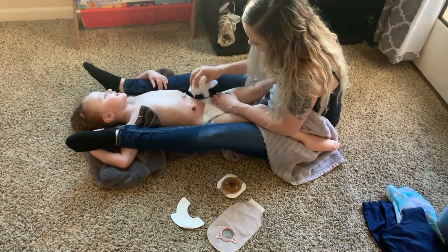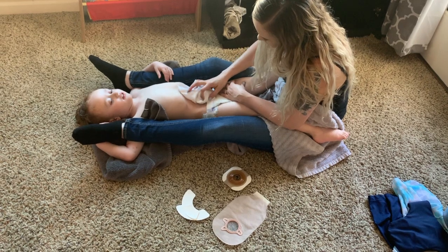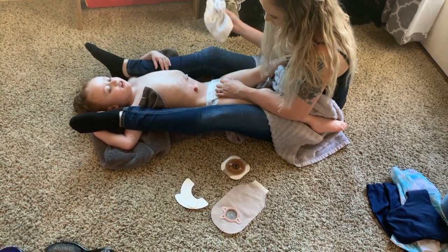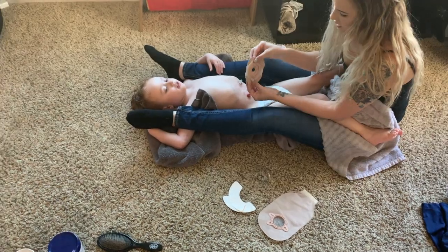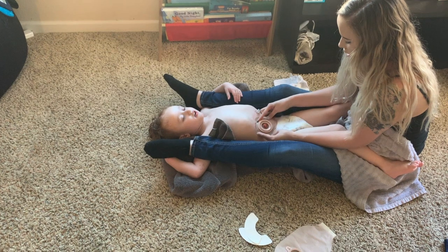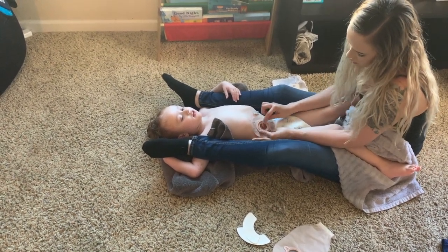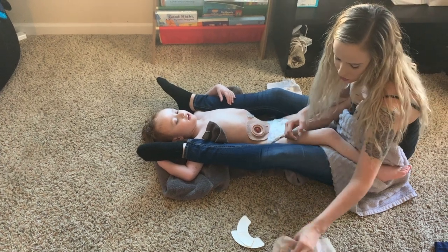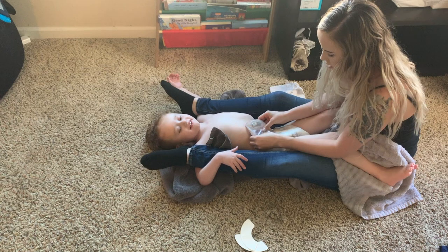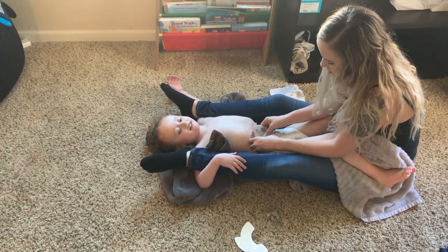So we just got Keegan out of the bath, and now we are making sure that his body is dry around where we have to put the ostomy bag and the adhesive on. It's pretty simple. This just goes right on here. I've pre-cut it to the size I know Keegan's stoma is. So this red part right there is just called the stoma. And this is the bag that just attaches to the part here. You want to make sure you get that on real quick before obviously any poop comes out.